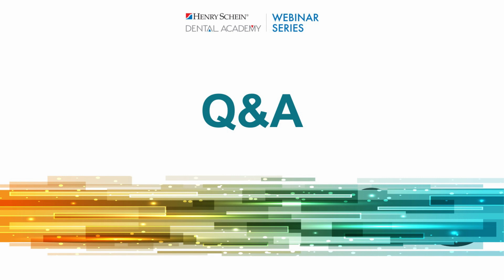Our next question, how does the Kois deprogrammer work? It's a great tool. You can look up the Kois deprogrammer and what it is. When you're opening the bite, a Kois deprogrammer is an appliance. It's much like a Hawley appliance with an anterior discluding element that fits behind your upper centrals, and your lower two centrals just touch, and it's slightly open to give clearance to the posterior teeth.